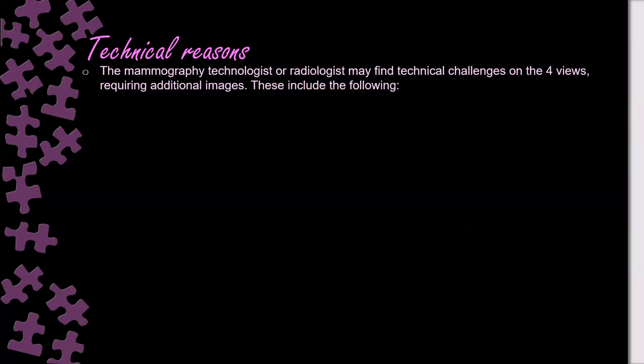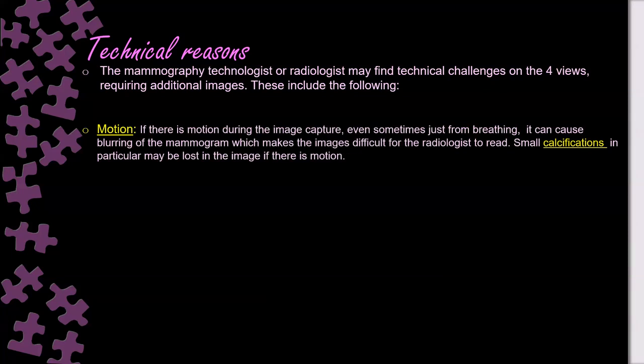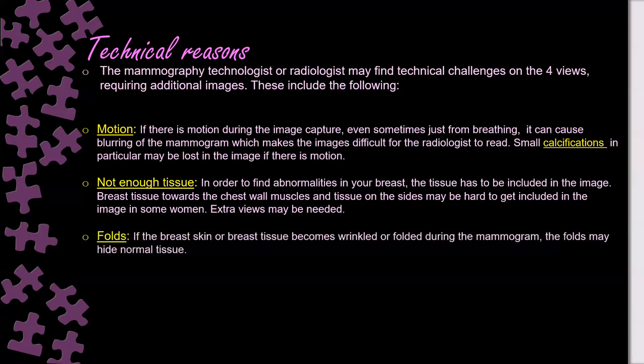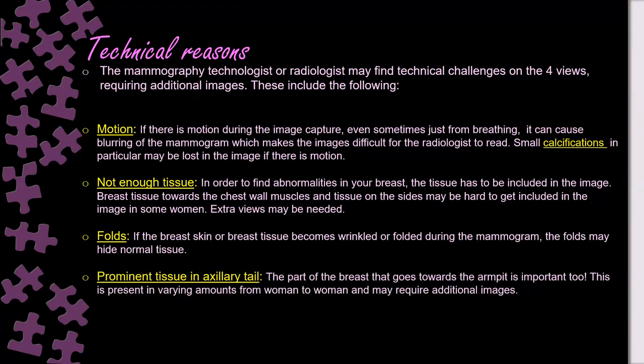Okay, the technical reasons: the mammography technologist or radiologist might find technical challenges in the standard views requiring additional views, which include motion, for example, blurring, motion artifacts, where small calcifications might be affected. So they might need to repeat the image for that. Not enough tissue, if not completely covered, if there is a skin fold or other artifacts affecting the image quality, or prominent tissue in the axillary tail.